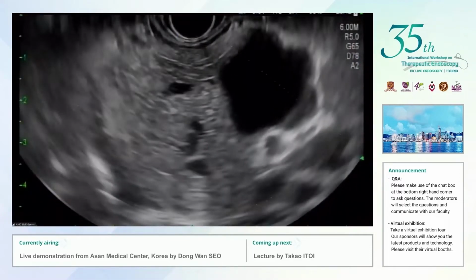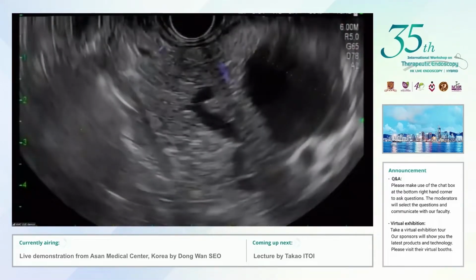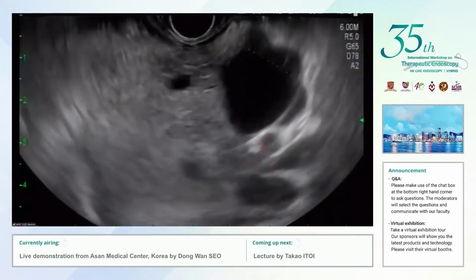Dr. Dongman, where are the worrisome features described before? A worrisome feature. Okay.